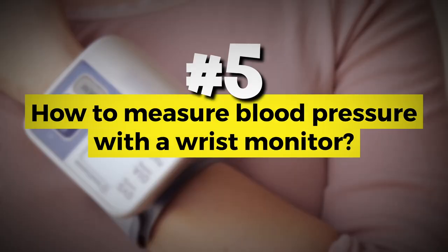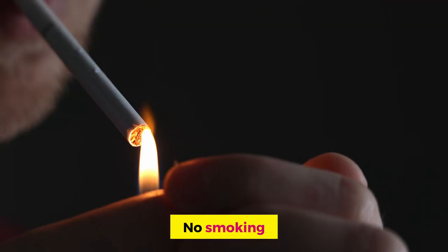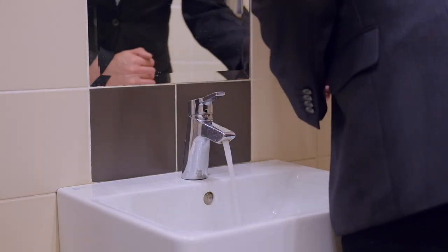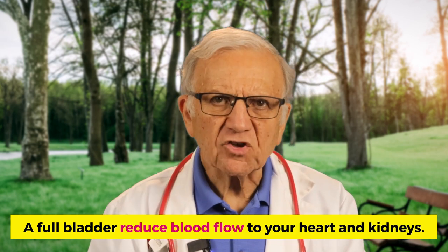How to measure blood pressure with a wrist monitor. Let's look at before the test and during the test. Before the test, make sure you do not drink caffeinated beverages, smoke, or exercise during the 30 minutes before the test. Make sure you make a pit stop at the restroom, because a full bladder can actually increase your blood pressure — a full bladder reduces blood flow, causing your heart, kidneys, and body to elevate your blood pressure.